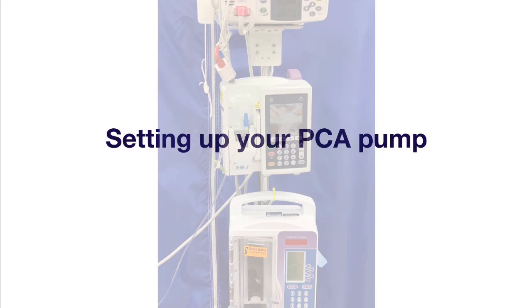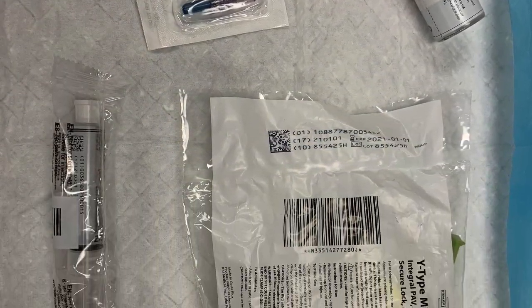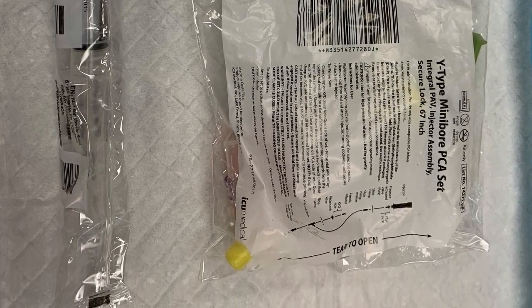Today we're going to talk about setting up and priming your PCA pump. First you'll need some supplies. Make sure you have your medication, a needless port adapter, a saline flush, and your IV tubing kit for a PCA pump.